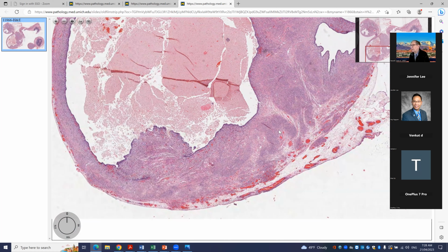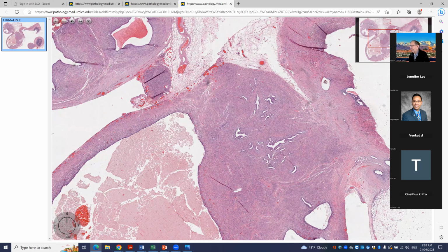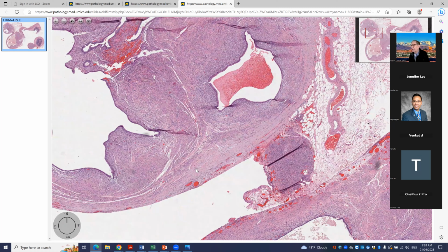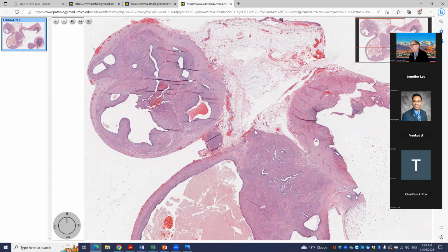It's just more organized like a tumor type of lesion with varying amounts of gland to stromal tissue. Here's more pure stromal type muscular tissue. And then next door we have these nodular clusters with central glands and stroma, more clear-cut endometrioid type differentiation with associated smooth muscle.